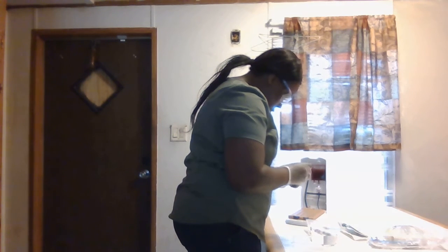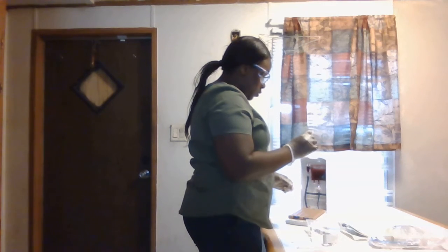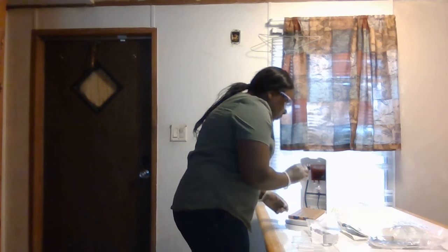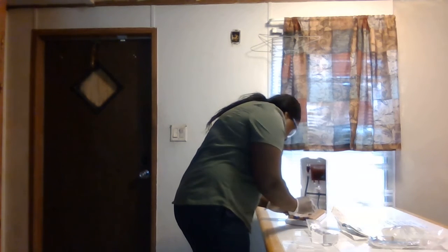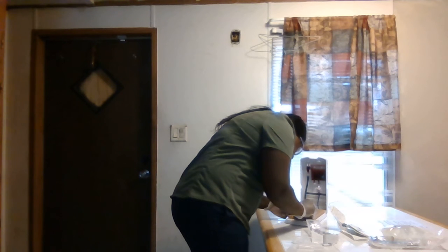And we're going to make sure, test it, and my needle is ready to go. Okay, so it's dried, and I can go ahead and insert with the bevel up at a 10 to 15 degree angle. Okay, so now I'm going in, bevel up.